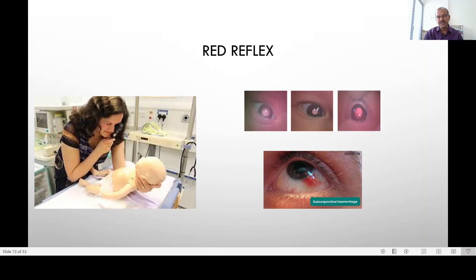In an awake baby, be very gentle. Do the red reflex at the start before the baby starts crying, because once the baby starts crying the eyelids are screwed in and you cannot really open them to see the red reflex well. If the baby doesn't open the eyes well, you can hold like this and rock the baby back and forth until they open slightly.